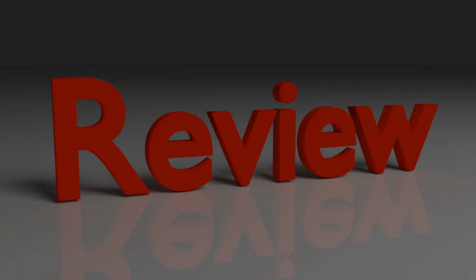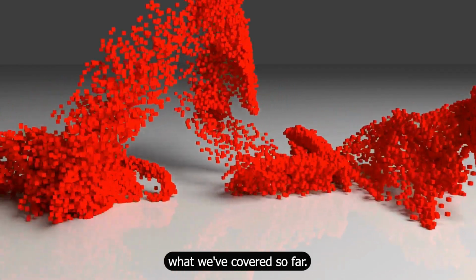Let's now take a brief moment to review what we've covered so far.